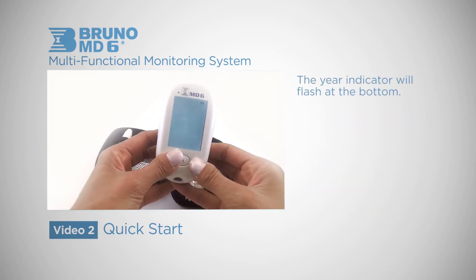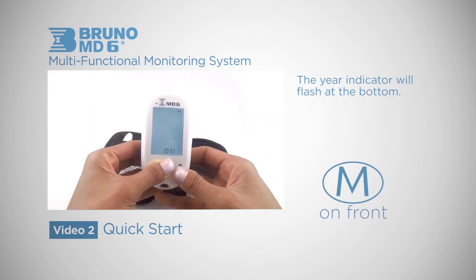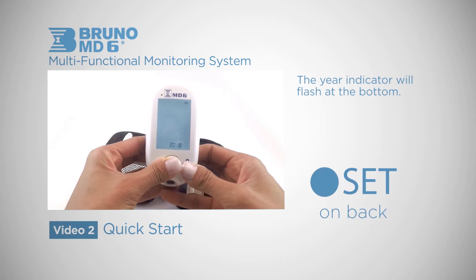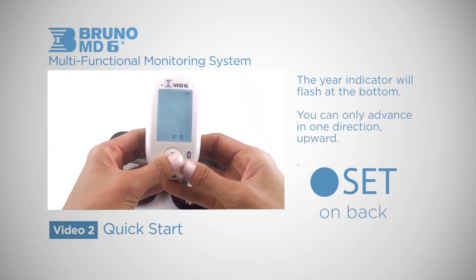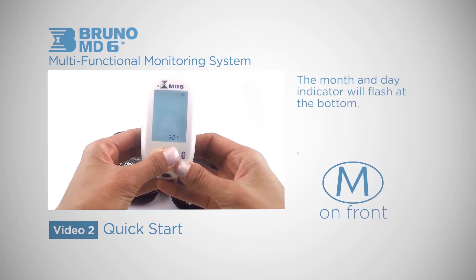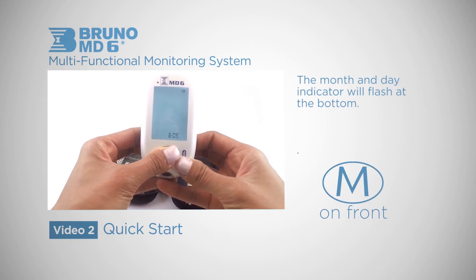The year indicator will flash at the bottom of your current screen. Hit the MAIN button until you reach the current year, then hit the SET button again to move on to the month and day. You can only advance in one direction — upward. Hit the MAIN button again until you reach your desired month, then hit the SET button to confirm and move on to the day.